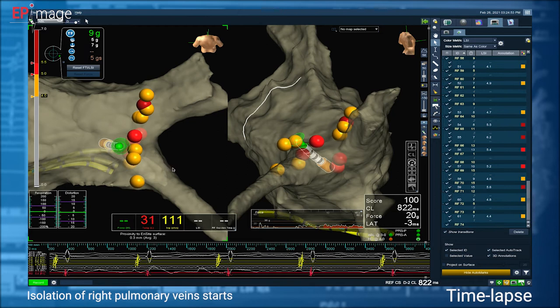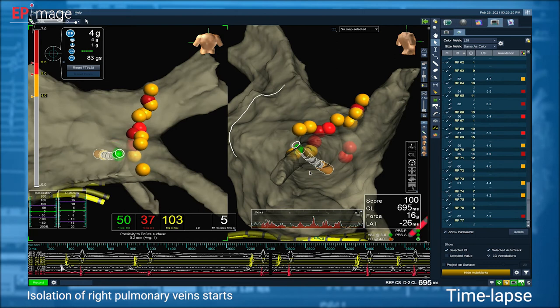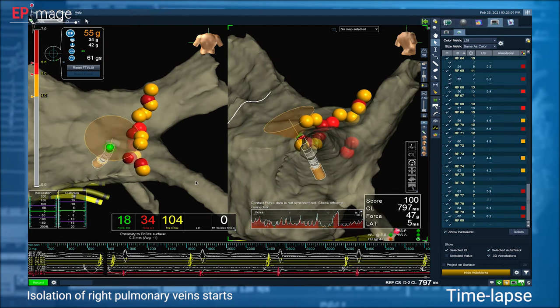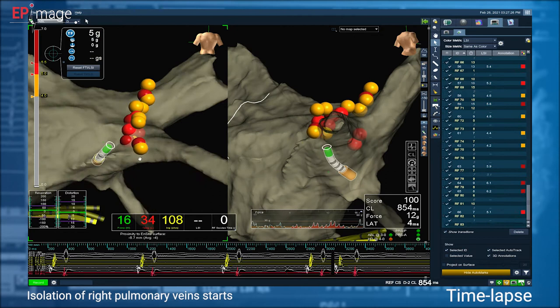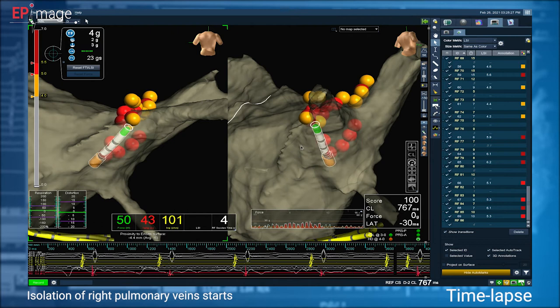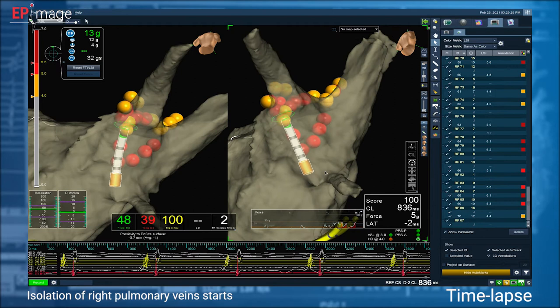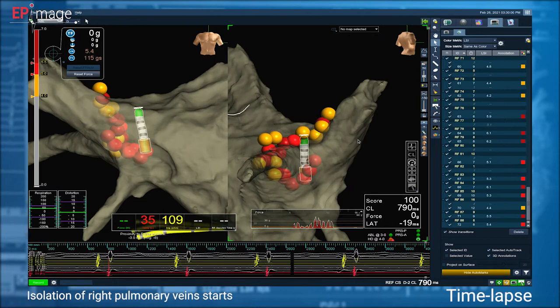Just to show you how the line appears point by point. And again, you see I'm jumping on the posterior wall, so giving some primary gaps, which I'm closing afterwards. Now we are ablating just below the right inferior pulmonary vein, and moving the 3D picture, we are constantly looking for any gaps, and if there are any, like in this position, I'm trying to close them. So we'll move on to the anterior portion now.